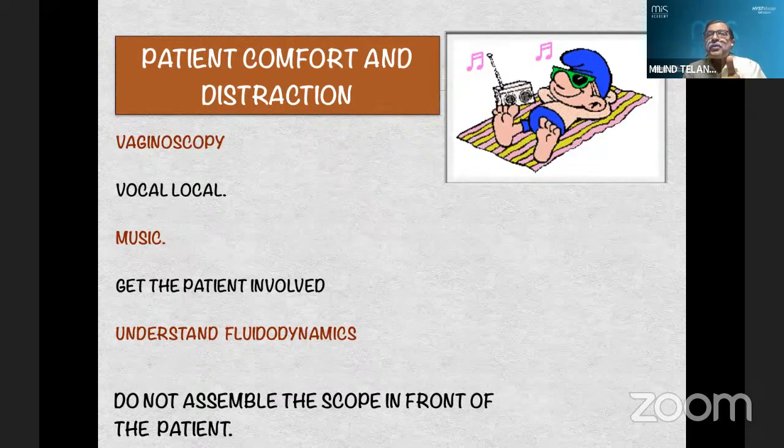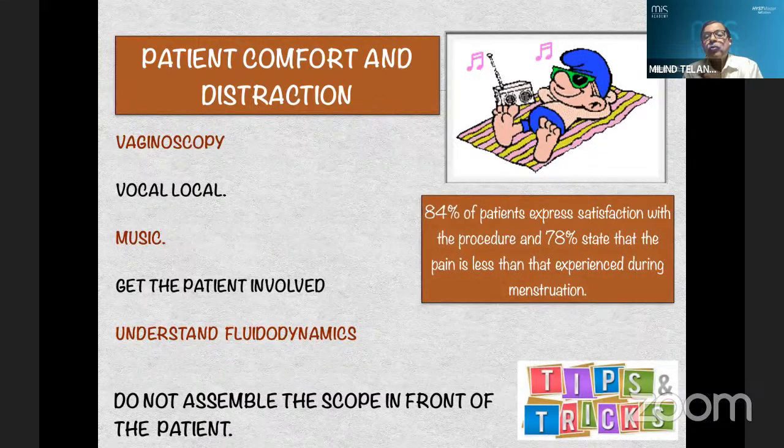Use vocal local. Have an assistant at the head end talking to the patient, asking her about her family, her children, and see how she responds. You can use music. I've used music also on my mobile. Get the patient involved and understand the fluidodynamics, that is, low pressure enough to open up the cavity. So what happened after doing this? 84% of the patients expressed satisfaction with the procedure and 78% stated that the pain is less than experienced during menstruation. Now, this is what has to be imbibed by everyone.